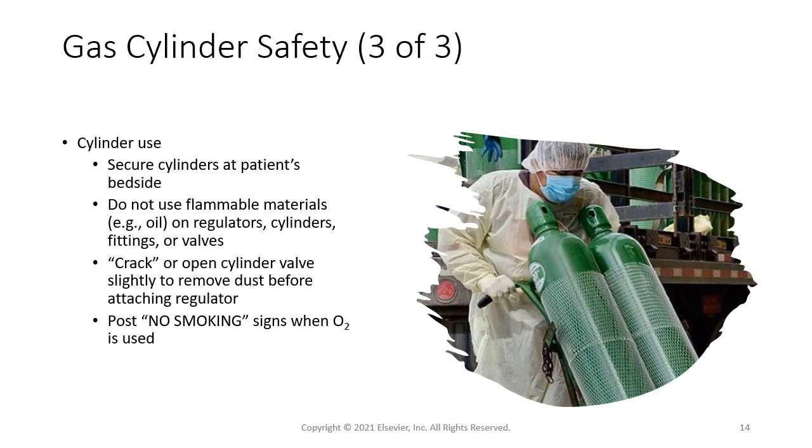Cylinder transportation and cylinder use. Use cylinder carts with a securing mechanism as pictured here. Keep protective cylinder caps, also pictured here, in place during transportation, and protect gas cylinders from striking other cylinders or objects to avoid damage to the safety devices, valve stems, and the cylinder itself. Avoid dropping, dragging, or rolling cylinders when in transport. Do not transport cylinders for use that are not appropriately labeled.